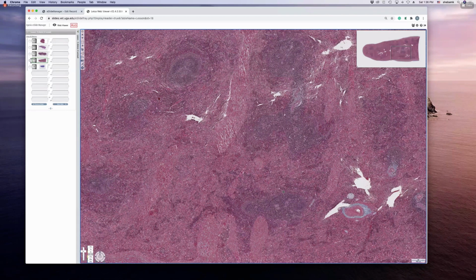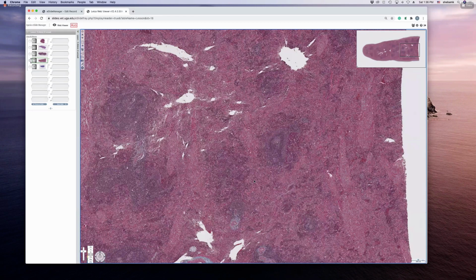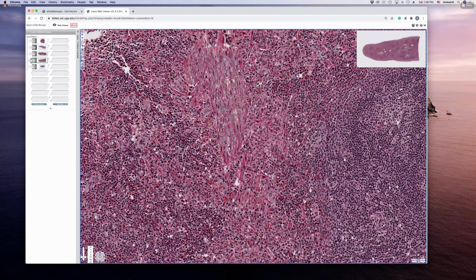But here the distinguishing feature is the presence of these capillaries in the marginal zone or even in the sinusoid. Look at this, that are encapsulated. See, like here, these are capillaries, but they are covered by macrophages sitting on top of them, waiting for these dying red blood cells to come out. So that's an ellipsoid right there.